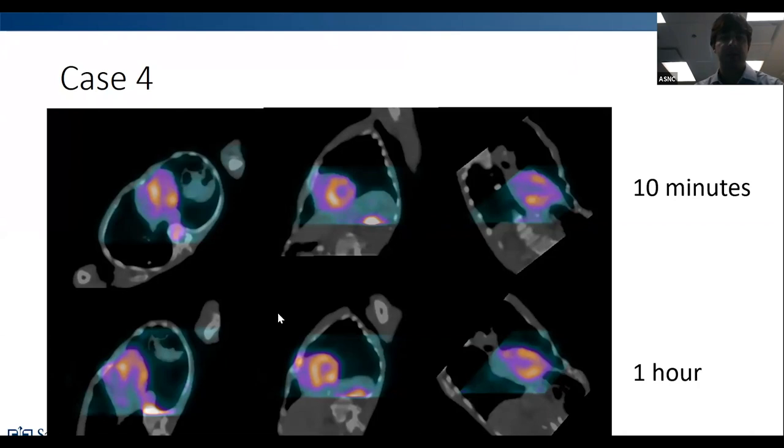But when some patients were studied with one of the other European tracers, they found that myocardial uptake happens very quickly. And so maybe SPECT will help us push this time frame earlier and earlier. Again, not something we recommend doing, something we're currently studying.